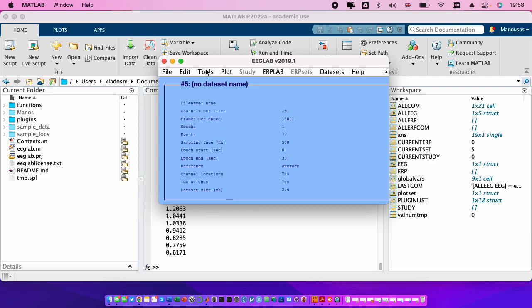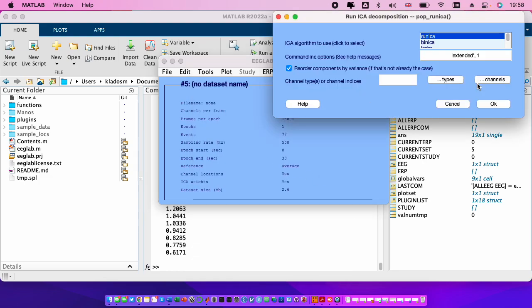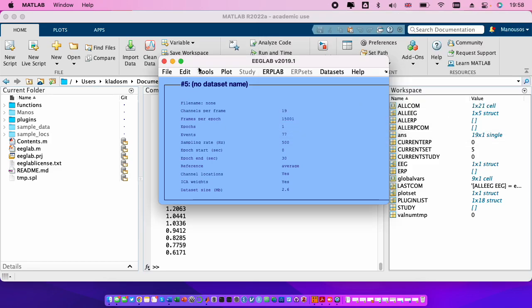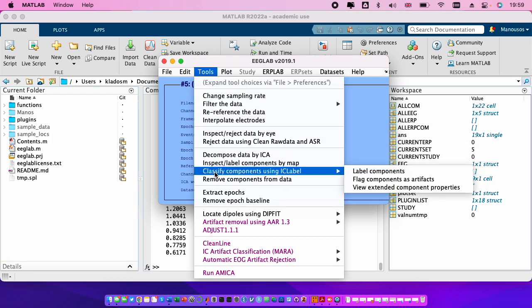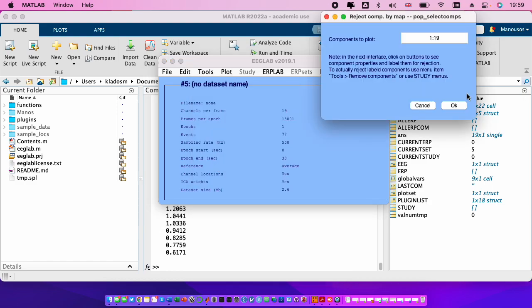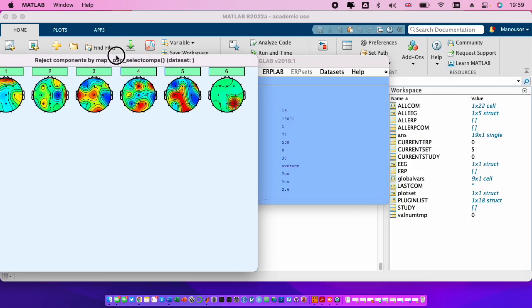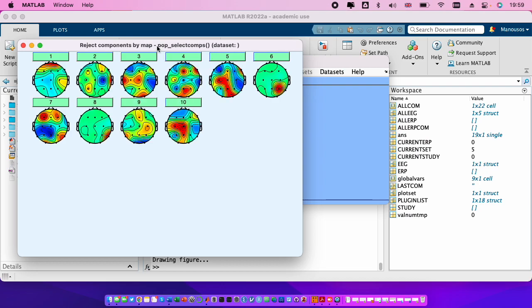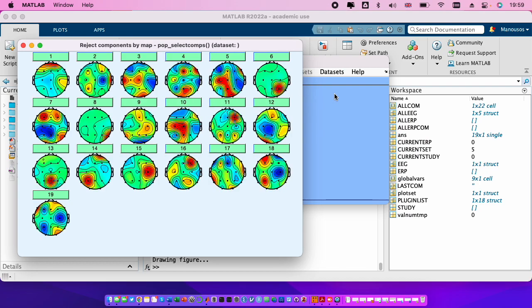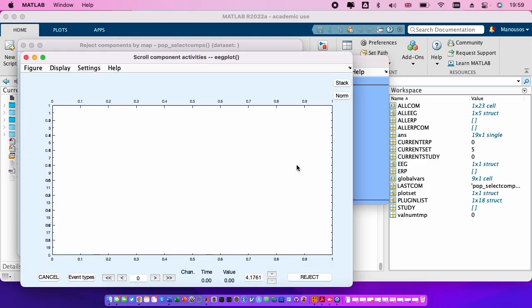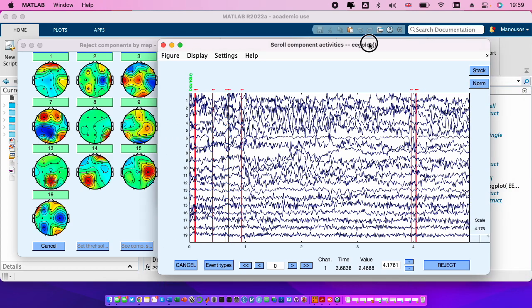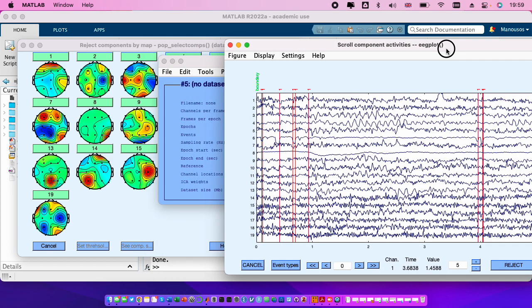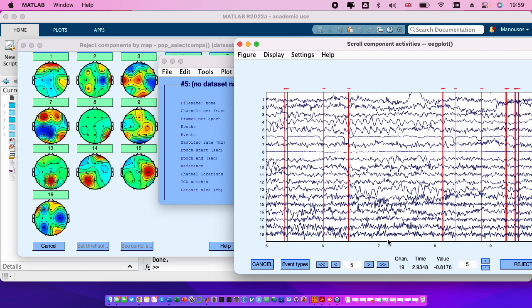Let me finish the tutorial now. We decompose the data, tools, decompose data by ICA. I would do that. Sorry, then tools, we need to inspect and reject the data. So we need to plot the topo plot maps. It's also good to plot the scrolls of the independent components. So we go to plot component activation scrolls.